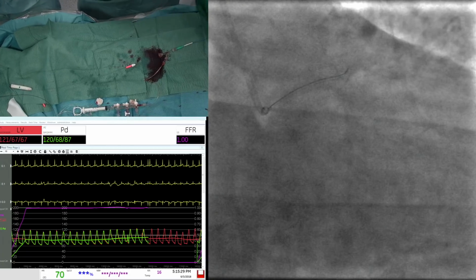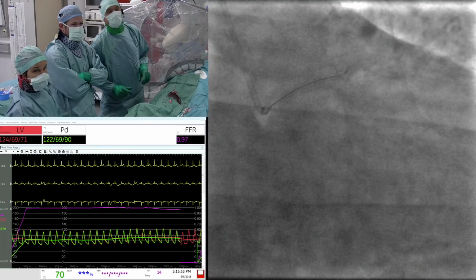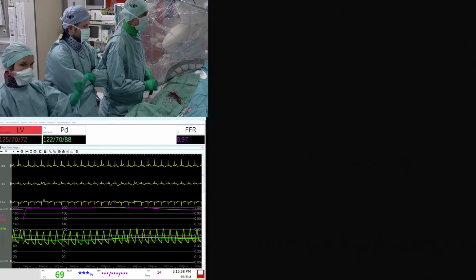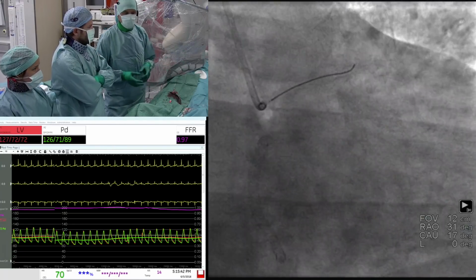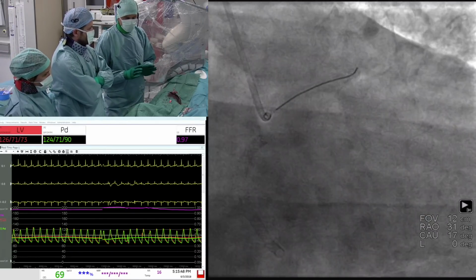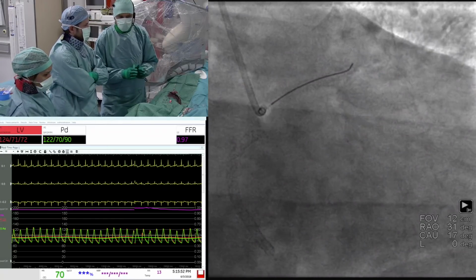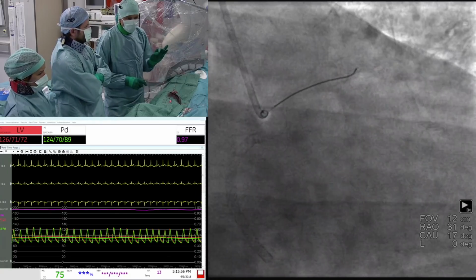Now the very place to equalize, Eddie, the very place to equalize is there. So I will film it. It is with the sensor just next to the pressure, to the exit of the guiding. The goal of the equalization is to have the two systems speak the same language, so to speak. Okay, so this is the place where we are going to equalize.